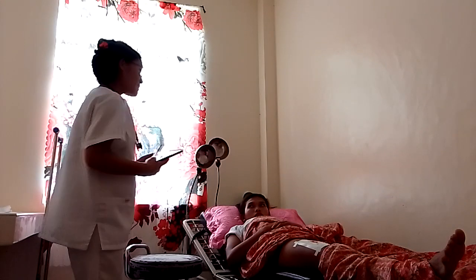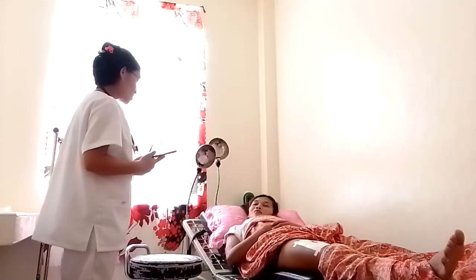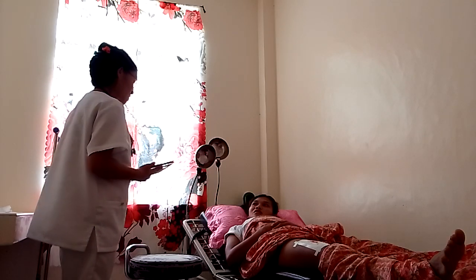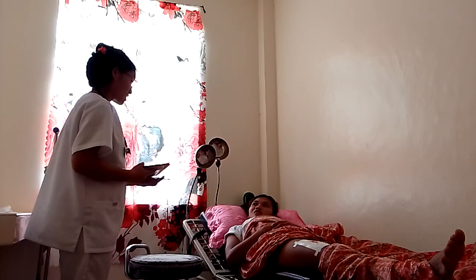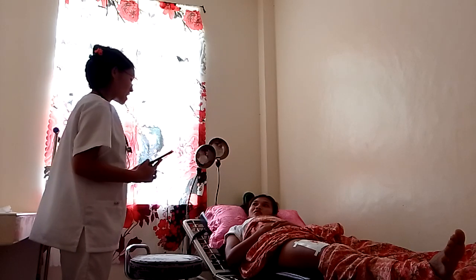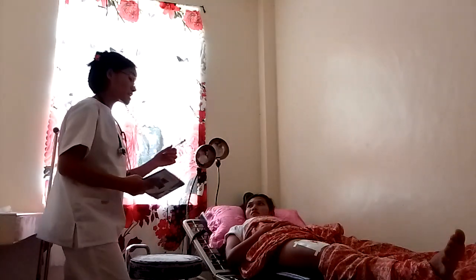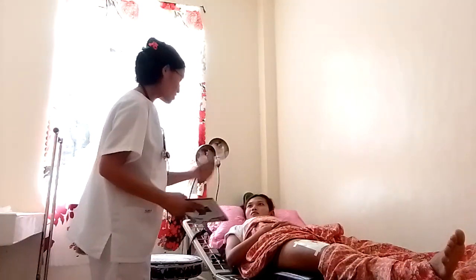The next step that we need to do is verify first our patient kay basin makasulod ta sa sayop nga room o makahatag ta sa sayop nga pasyente. So kailangan ma-verify nato ang ato ang patient. Okay? So, hi ma'am, good morning. Good morning, ma'am. Unsa man ang imong ngalan? Si Jaymisa, ma'am. So, Jaymisa, okay. Ako si Giselle Bulpatuting, ma'am, and I am your nursing assistant for today. Karon ma'am, magbuhat ta og wound care procedure. Unsa man na siya? Wound care procedure, maglimpyo ta sa imuha nga samad from wet to dry dressing.